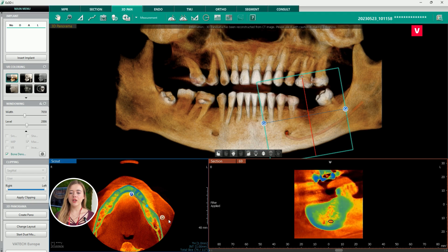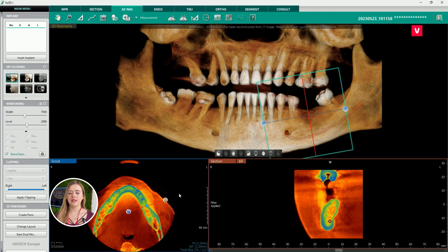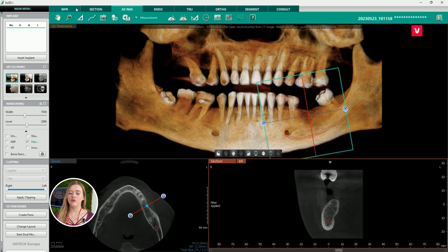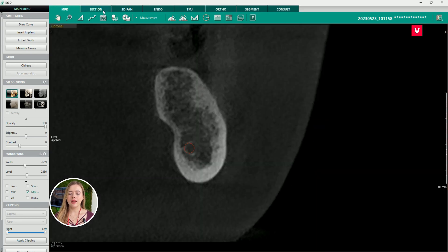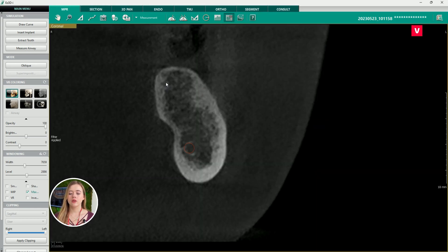Another helpful function for bone density qualification is ROI — region of interest. If we select the area of the potential implant, this tool will show us the average bone density in that area.